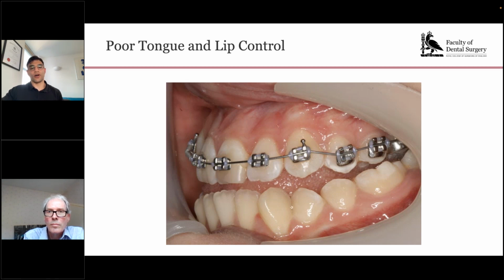And personally, what I would do is have some kind of scale next to it. So if you have a ruler, hold a ruler up to the lesion in the photograph, so there's an accurate depiction of how big that lesion is, and whether over the passage of time it's gotten larger or smaller, and you can document that. But I wouldn't particularly do much differently to what I've described here. I'd just make sure that there's some kind of record of its dimension.